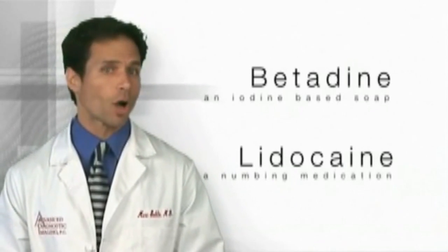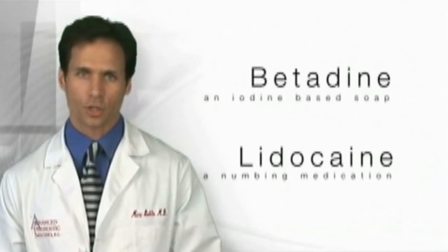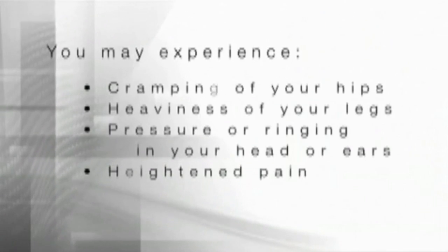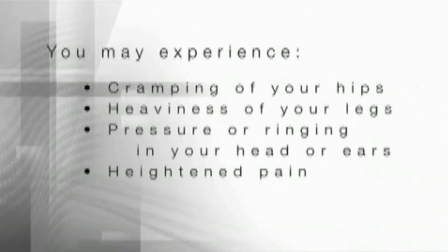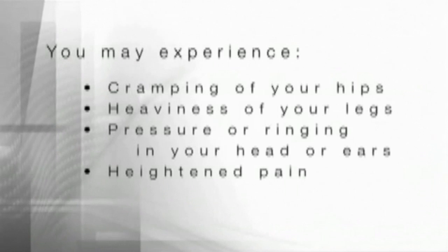The numbing medicine will cause a slight stinging and burning sensation as it is injected into the tissues. During the contrast material or dye injection, you may experience cramping of your hips, heaviness of your legs, pressure or ringing in your head or ears, or you may even experience heightened pain.